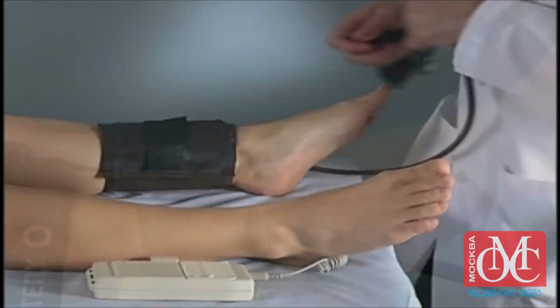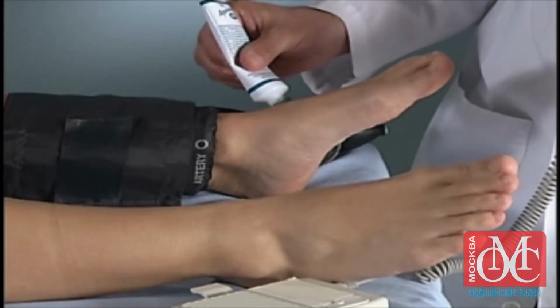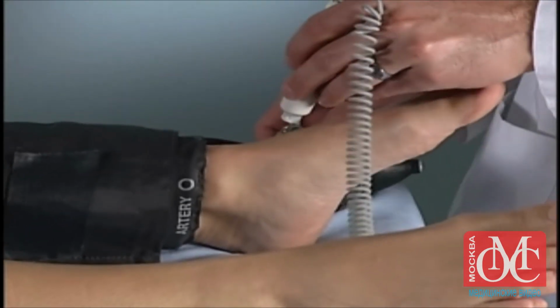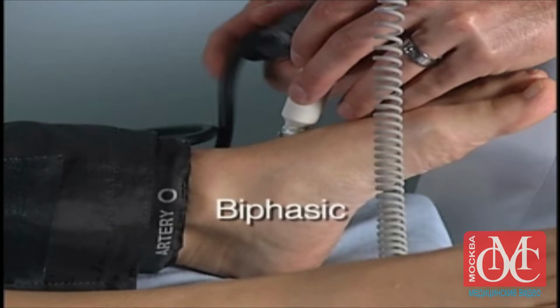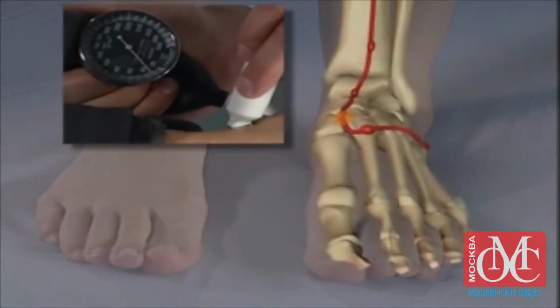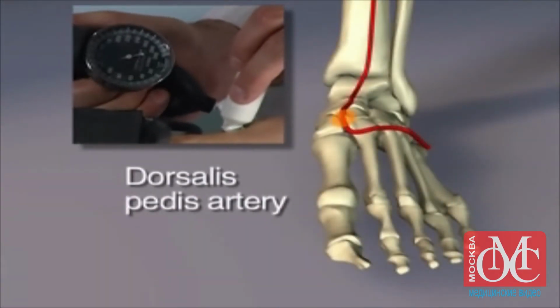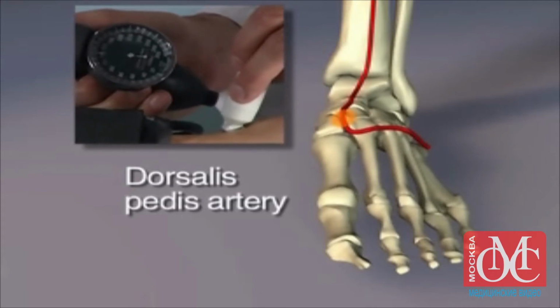The dorsalis pedis artery is located initially by palpation or identified by Doppler alone if no pulse is felt. You should obtain an arterial Doppler signal, which can be monophasic, biphasic, or triphasic. Apply the Doppler probe to this area and inflate the blood pressure cuff to 20 to 30 millimeters of mercury above the level of flow cessation. Then slowly deflate the cuff until you hear the sound of the systolic pressure and record it.